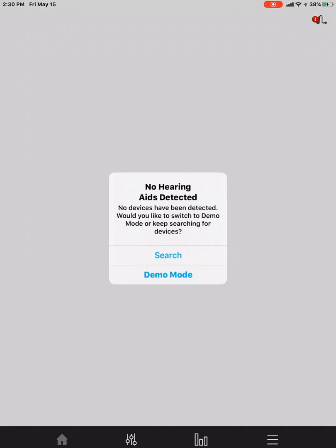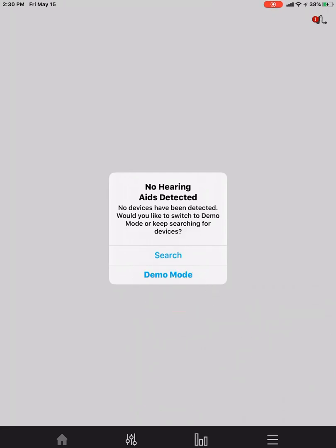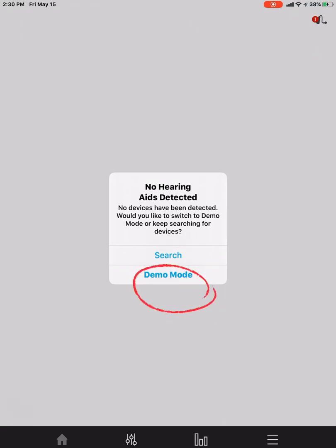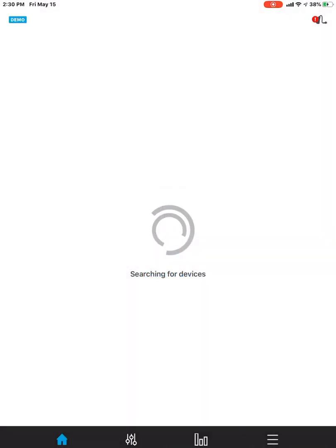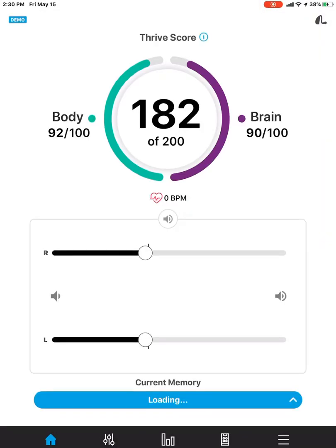So now it just prompts you. It says no hearing aids are detected. So it asks us if we would like to be in demo mode or if we should continue to search for the new hearing aids. So we'll select demo mode since we're brand new to the hearing aids and we haven't received our devices yet.